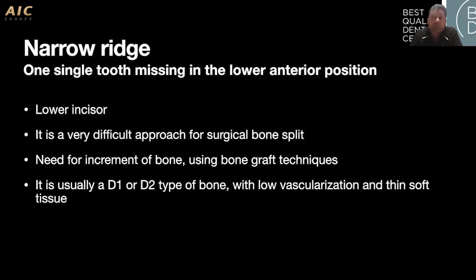So it's a bone graft procedure, and it's very important also to consider the position of this implant.